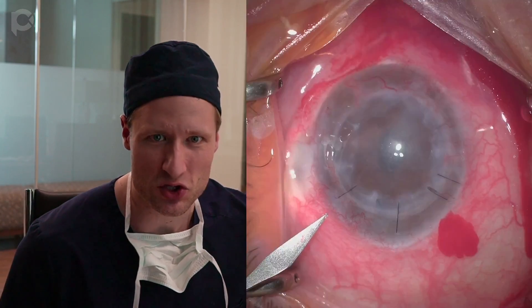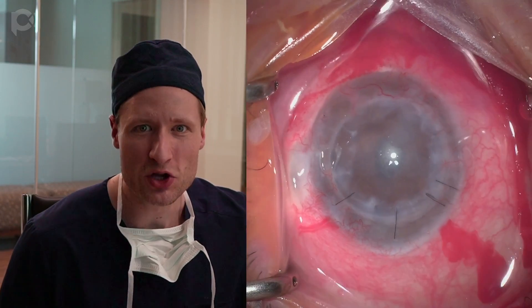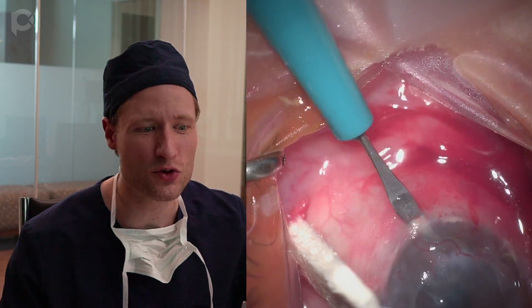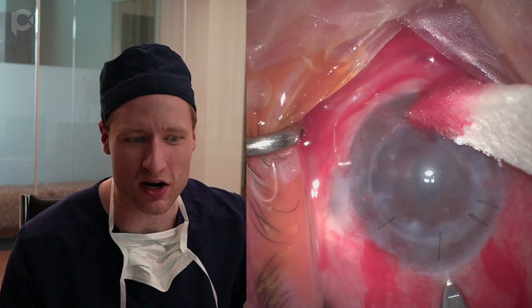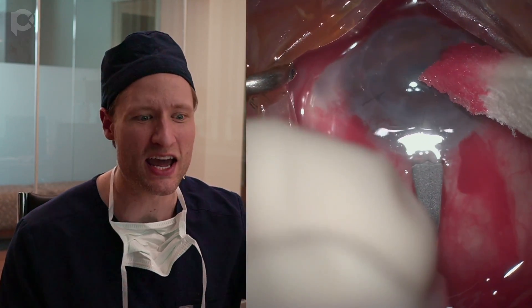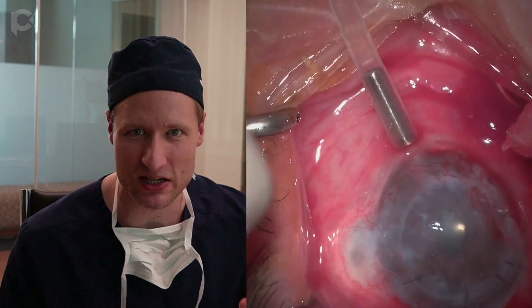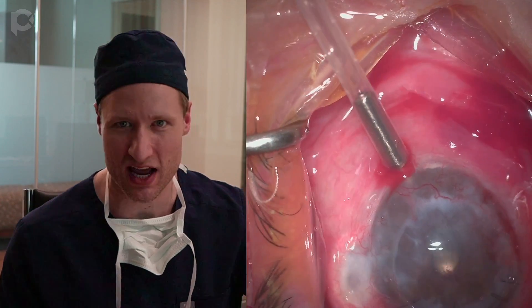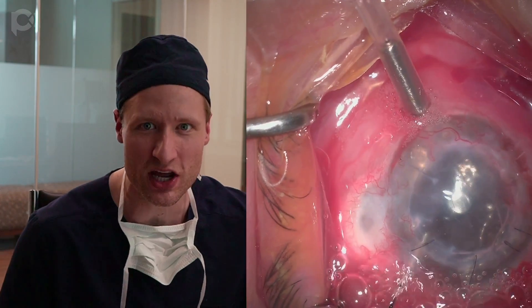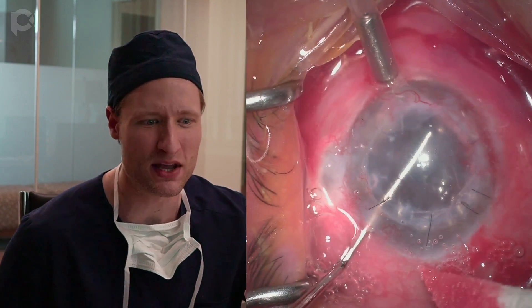We've taken him up to try to rehabilitate his penetrating graft with a DMEK. We're making our paracenteses and even our main wound in the sclera. I've had to learn this lesson the hard way: in eyes with previous PK, if you make corneal incisions you are asking for them to leak during and after the case. The eye is so much more stable if you initiate these incisions in the sclera and then tunnel up and in.